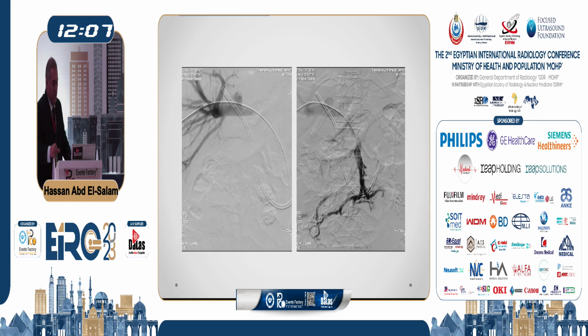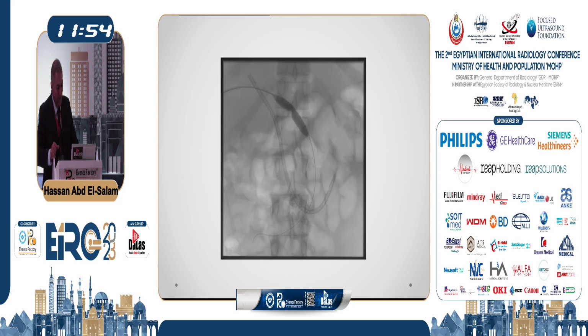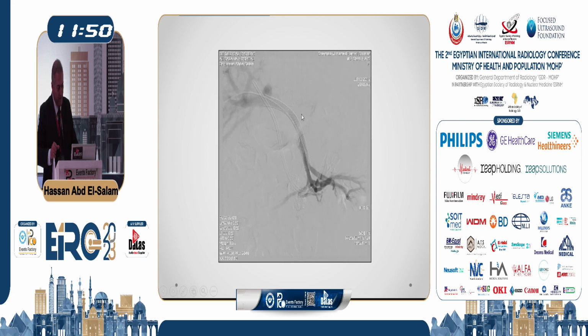So I went into the portal vein. You can see very tight stenosis in the portal vein here. This is the catheter being passed across the stenosis in the portal vein into the SMV, and we ballooned this stenosis and put a metallic stent into the junction between the SMV and the portal vein.